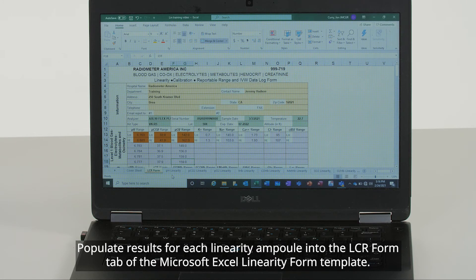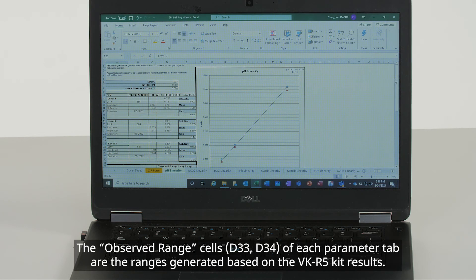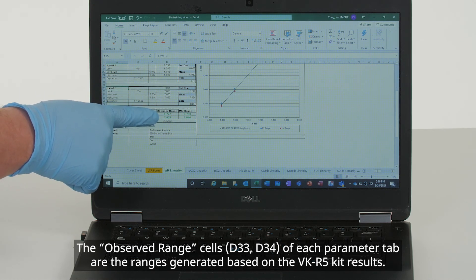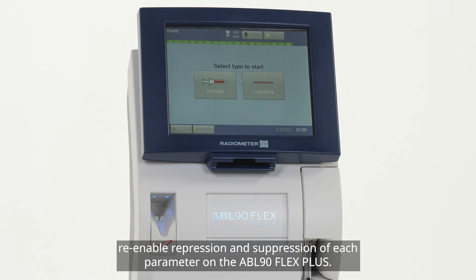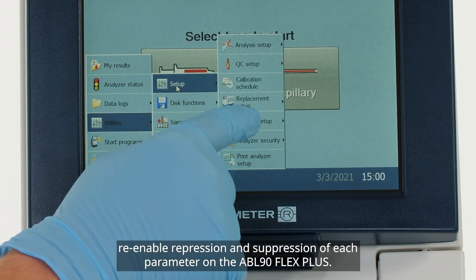Populate results for each linearity ampoule into the LCR Form tab of the Microsoft Excel Linearity Form template. Subsequent tabs will autofill. The observed range cells of each parameter tab are the ranges generated based on the VK-R5 kit results. You can print the entire Excel workbook for physical data storage. Once you have completed measuring the VK-R5 kit, which should be a minimum of 9 ampoules, re-enable repression and suppression of each parameter on the ABL-90 Flex Plus.